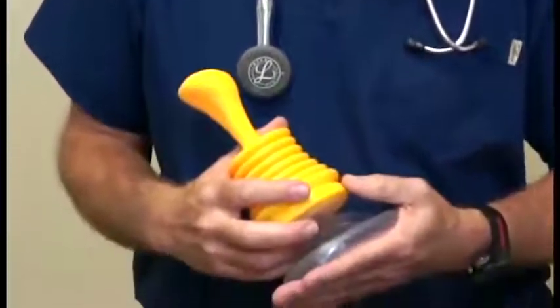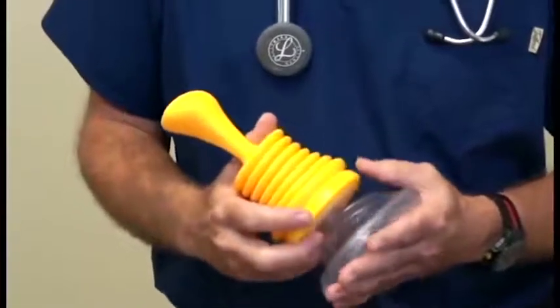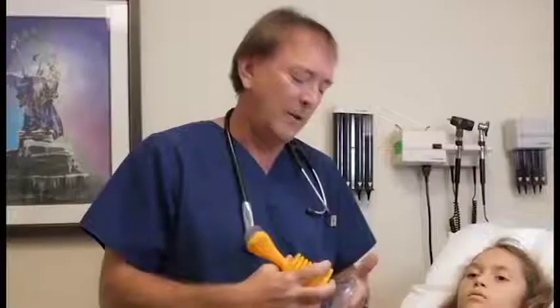The LifeVac is a new medical device designed to be used by any lay person in a medical emergency for young or old when you've lost an airway to choking. It's simple to use. Like any medical device, you really should try to get familiar with it before you use it. Learning how to use it in a time of emergency is the wrong time to learn — learn how to use it before that.